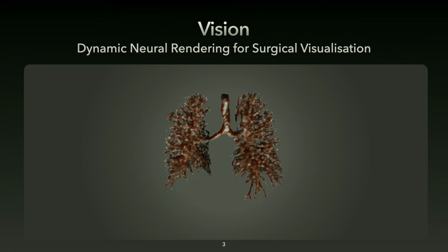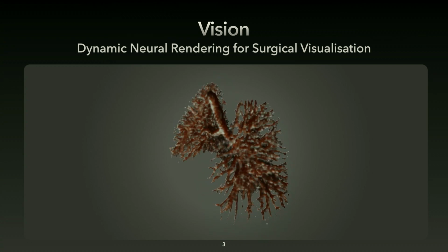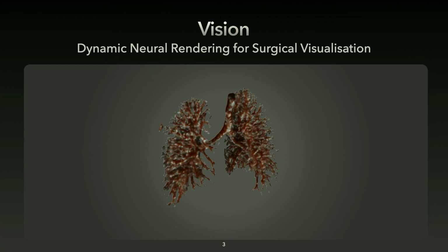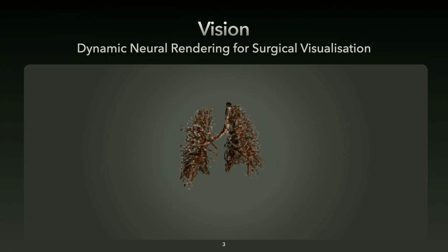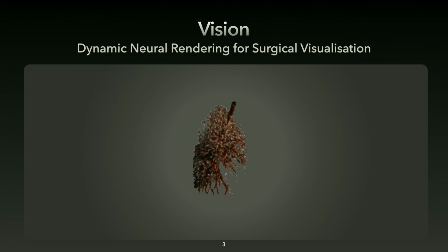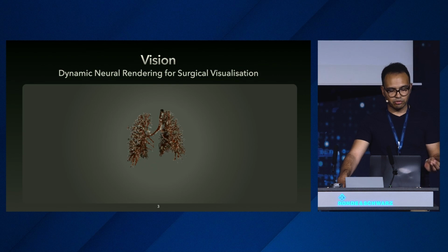It might be, for example, that there are some details there that one can improve based on the testing pipeline that one is using. But hopefully you can see it's breathing, and what you are seeing here is one component from a larger pipeline, a modular neural rendering system built to learn the 3D appearance of anatomy from limited inputs. So it's more like an immersive 3D reconstruction module.